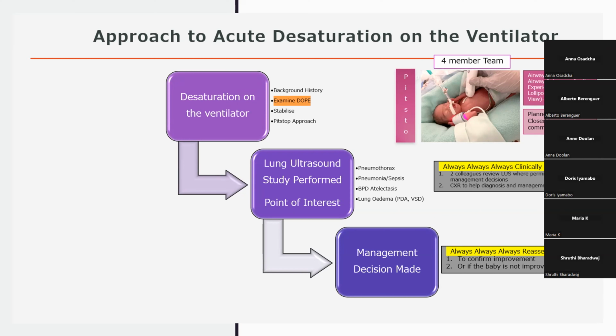Now, I'm going to talk to you about a clinical approach that we use, where I've trained in Southampton, something that I'm trying to set up in the Corniche as well, a concept called the pit stop approach. Why is that important? If you're using any diagnostic protocol, whether chest X-ray or lung ultrasound, you sometimes have to do that while the baby is clinically deteriorating.